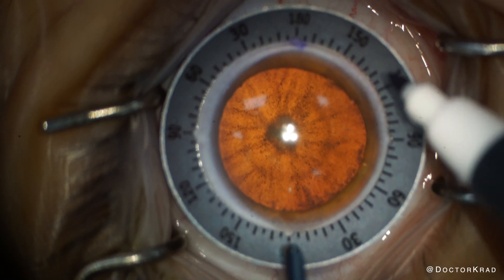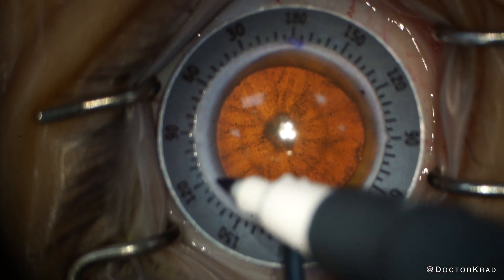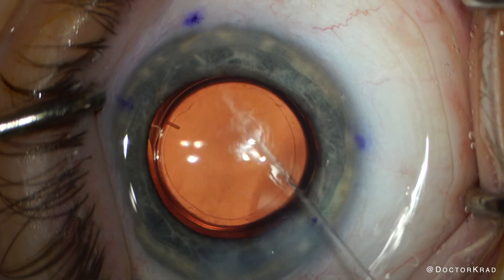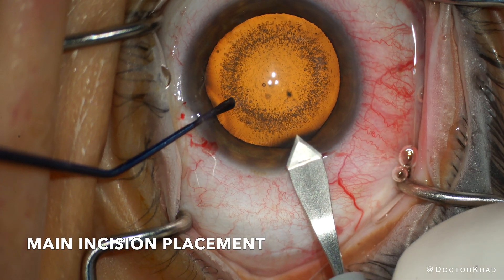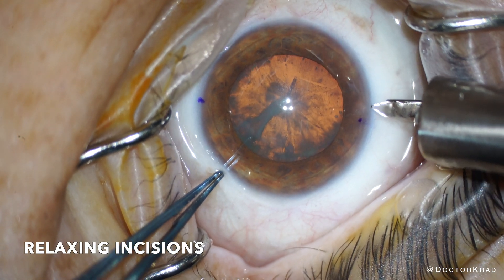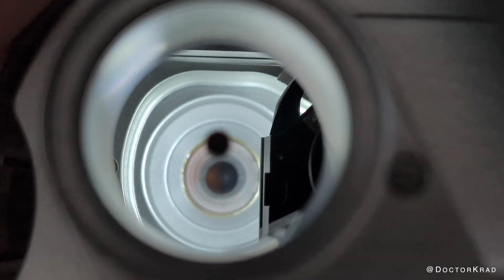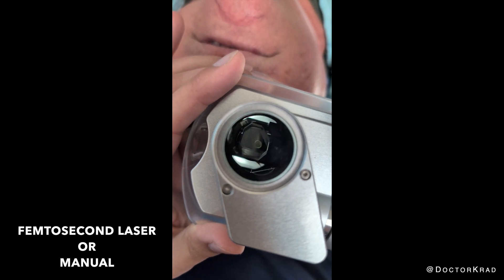Reducing astigmatism can improve the quality of your vision while you're not wearing glasses. At the time of cataract surgery, one can reduce astigmatism with a lens implant such as a toric lens or the light adjustable lens. You can also reduce astigmatism by strategically placing your main incision, or by creating relaxing incisions called LRIs or arcuate incisions. Historically, these LRIs were divided into either laser LRIs or manual LRIs.